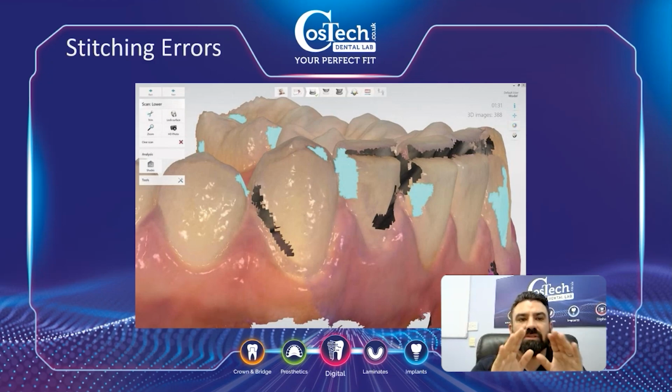The other thing that happens is when you're going from the posterior area, from the distal to an anterior area, it can sometimes drift. So you'll get one which will go forward and one will go there, and then it's not actually matching up. Whereas if you've got a good, reliable scan all the way across, it will make sure that it stitches properly. Stitching usually comes out as a grayish line. Sometimes it will look like it's actually gone through each other.